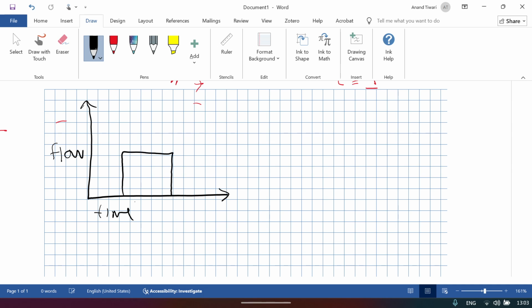Where do you see a constant flow pattern? In the volume control mode of ventilation, and expiration, as I told you, is passive exponential decay. This expiration flow pattern is common in both volume control and pressure control. In any mode it is common because it's passive.